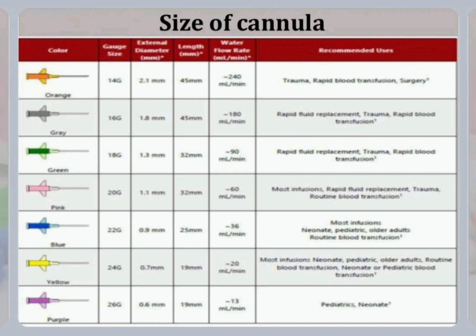Inshallah, in the next class we are going to learn how we do the IV cannulation, what its parts are, what the proper procedure to do the IV cannulation is, and how to find the IV line in an expert way.